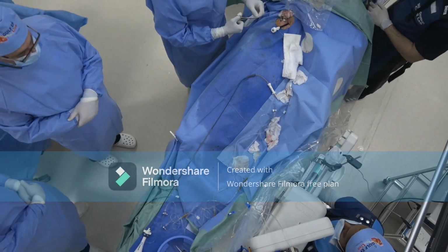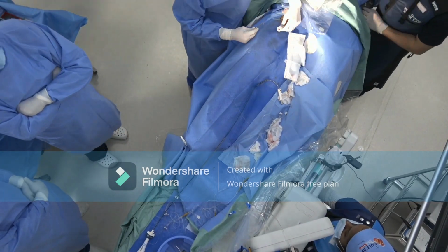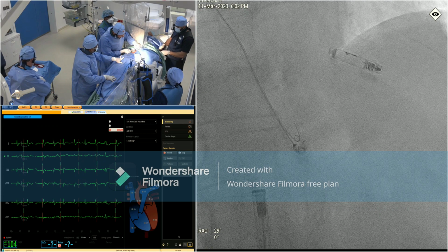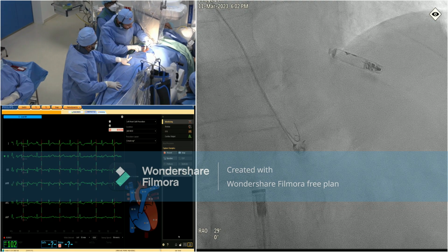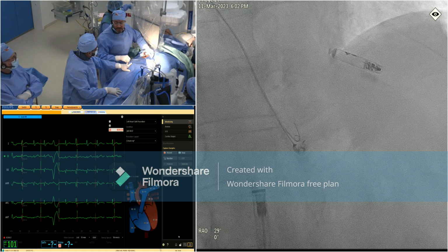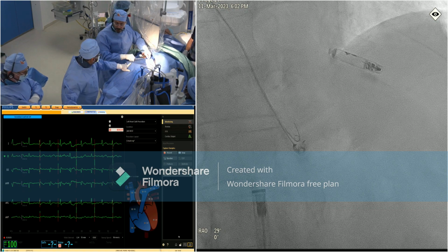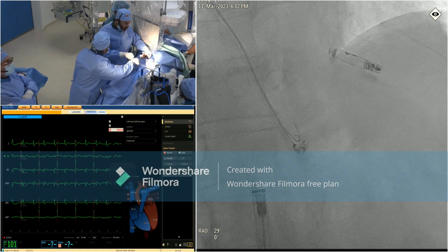So here we are doing the figure of 8, and then we will take the sheath out, and the procedure is done. Just fix his leg. As I mentioned, he's an elderly gentleman with a spine procedure before, and he also has some sort of chest problem. So we are not doing this, of course, under general anesthesia. I cannot recall we did it to any of our patients under general anesthesia, especially as they are elderly with multiple comorbidities. So hopefully, when we have the upgrade in the future, we might start doing it more in younger patients. Cut, please.